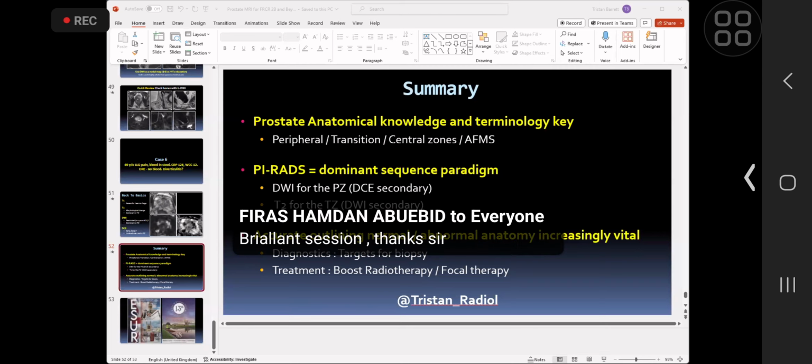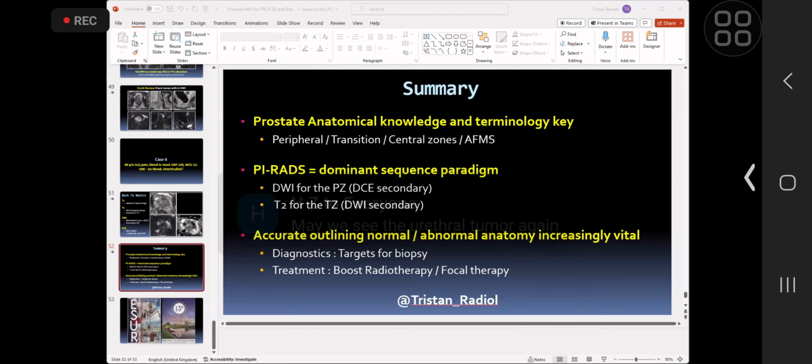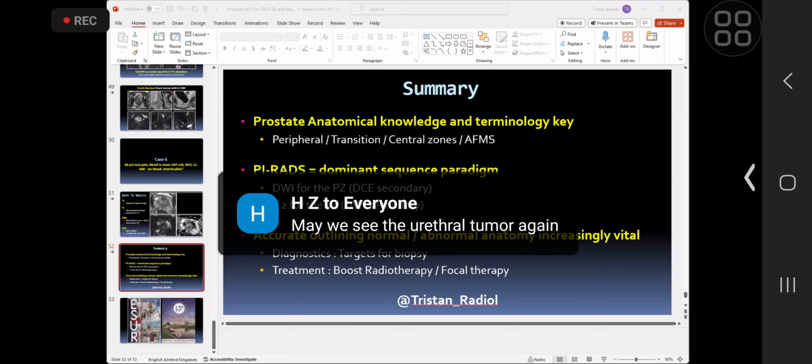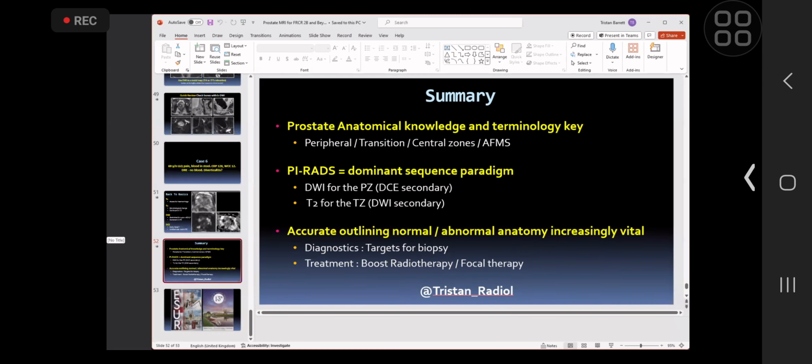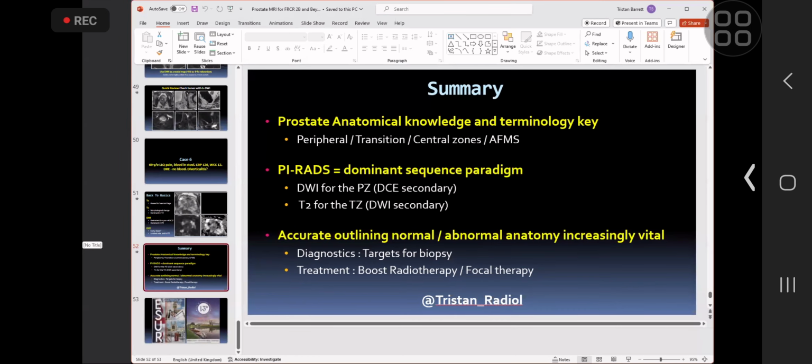Mm-hmm. But just a quick question. One of your slides told us that axial is the key axis, right? You start from axial and apparently from T1? T1 axial as well, yes. Your viewing protocol, just a summary of it. You T1 axial? Yes, I can give you that.